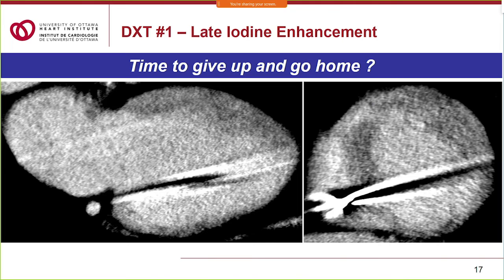He had a defib in, obviously, but terrible artifact everywhere. And I looked at these images, and I played with them for about 2 hours, and I thought, I can't see any scar anywhere. What am I going to tell Callum? This isn't a good advert for CT scar imaging.